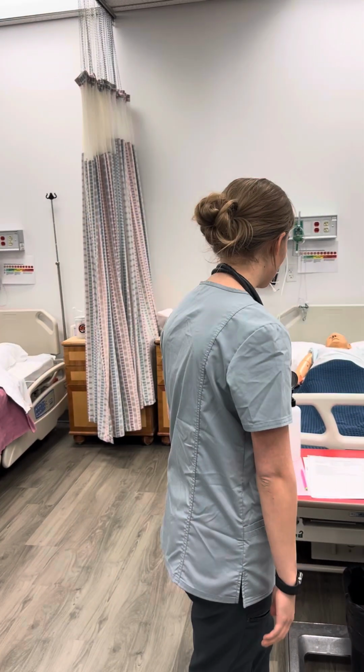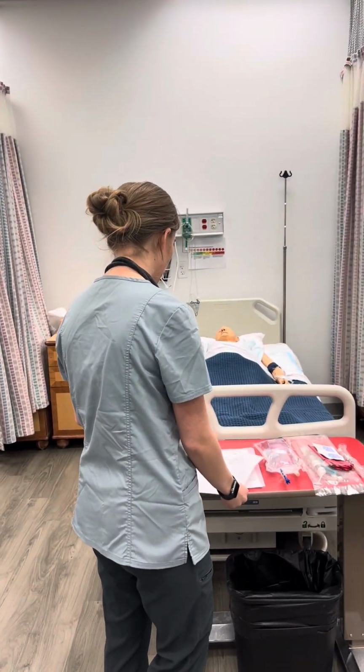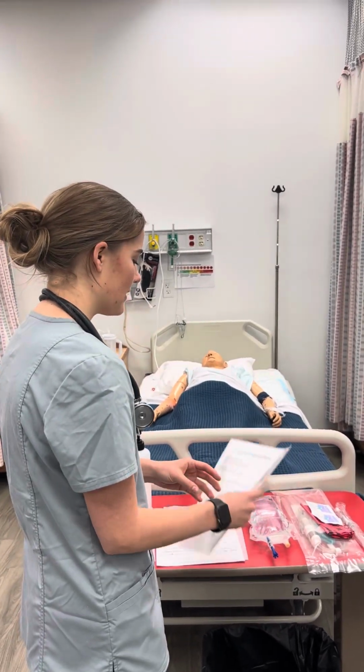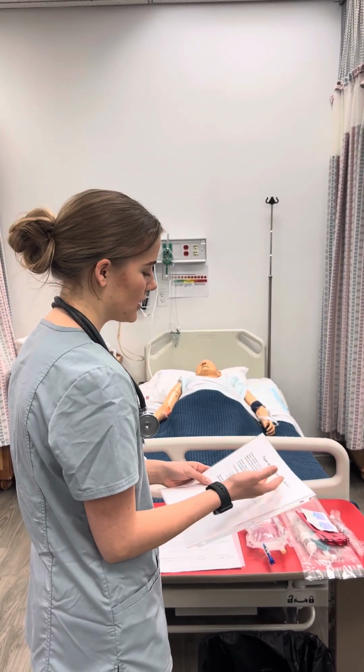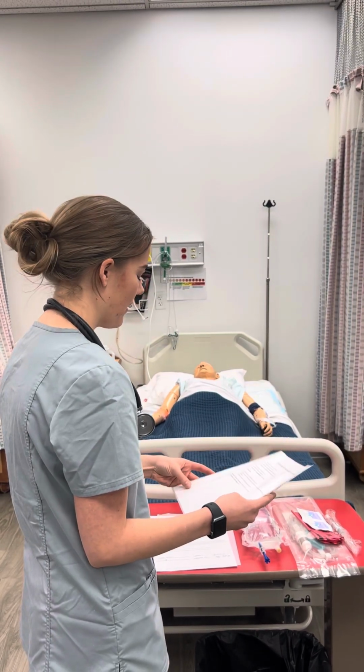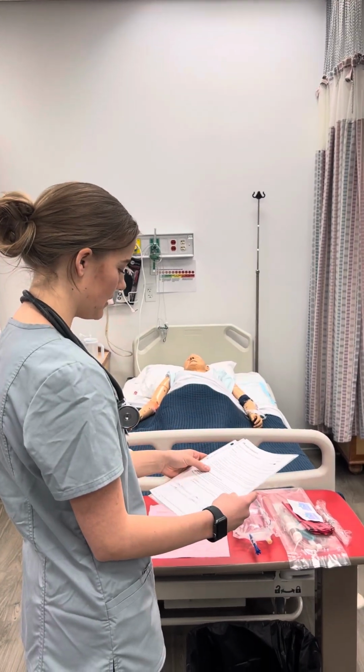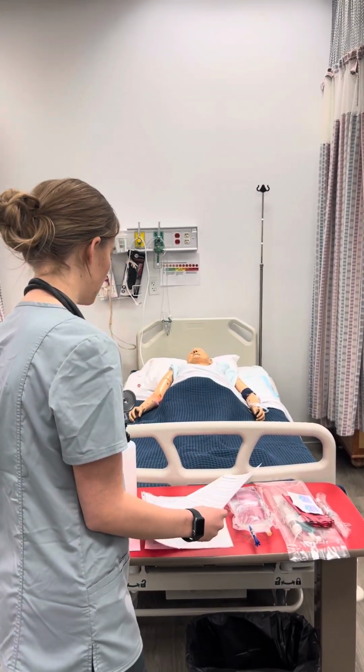So I'm just gonna be checking my patient's orders first, making sure that there is an order for the blood transfusion and that my blood has been typed and cross-matched, which looks great here. And I'm gonna make sure that my patient has signed the consent form. It looks like he did, and we're just gonna go talk to him about that real quick too.